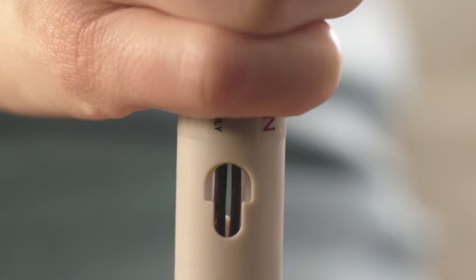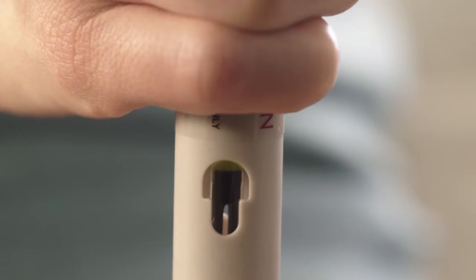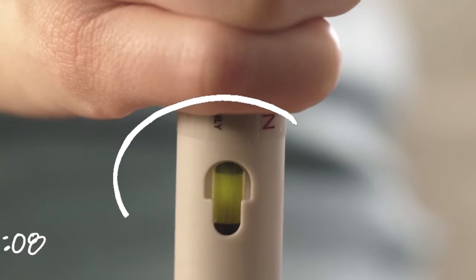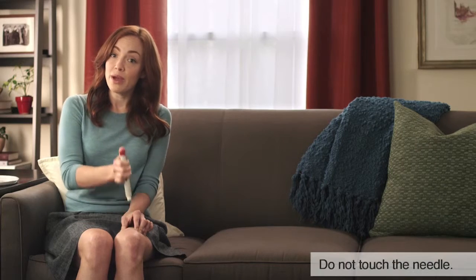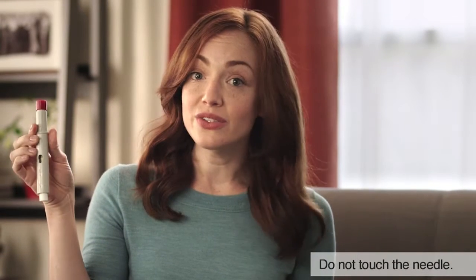Now I continue pressing the button and holding the pen against my skin for 10 seconds to make sure that all of the medicine is injected. I know the injection is finished when the yellow marker in the window has stopped moving. And then I pull the pen away from my skin. The white needle sleeve will move to cover the needle tip. Make sure you throw away the pen immediately into a sharps container.